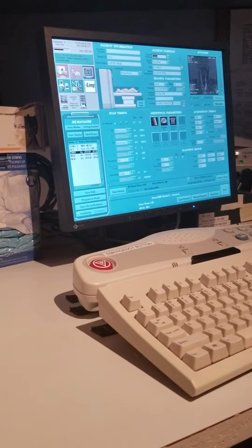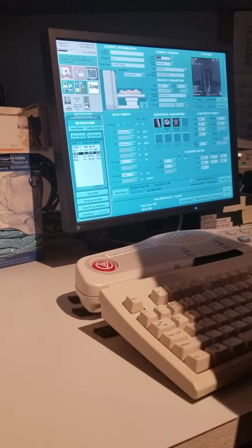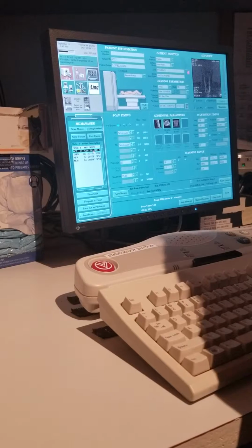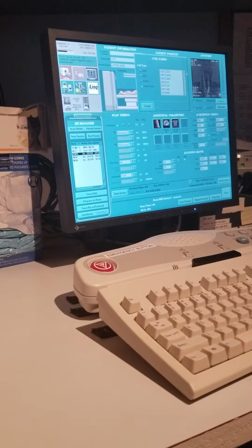We have to change it again. Yeah, I told you, you have to change it every single time. Oh my goodness. What do I gotta remind you? Yeah, I forgot. Yeah, you too. Okay, I'll take that. No, don't worry about it. You want to do it again? No? Nah. We'll do it on the next page. Okay. So just change it now. Yeah. This one.